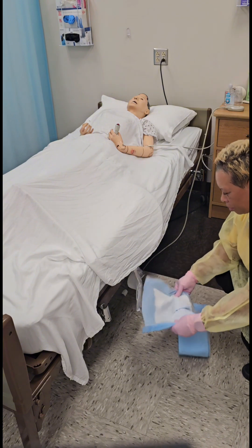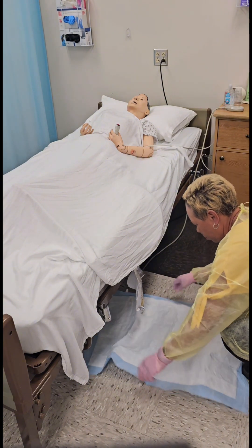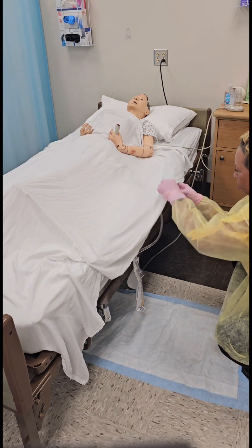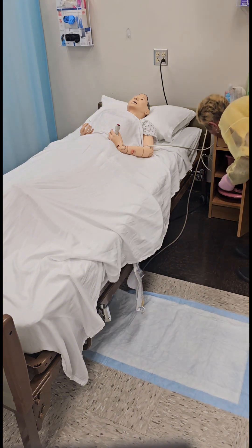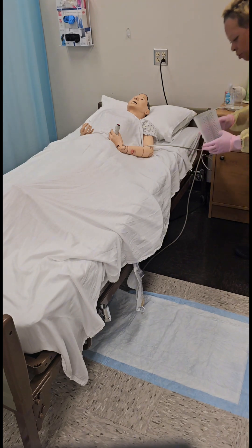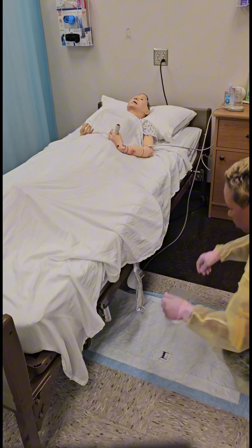Ensure that the drainage bag is not touching the floor. If it is, raise the height of the bed until it is no longer touching the floor. Place the clean barrier on the floor underneath the drainage bag. Check for kinks in the tubing. Gather remaining supply items: one alcohol wipe and a graduate. Place these items on the clean barrier on the floor.